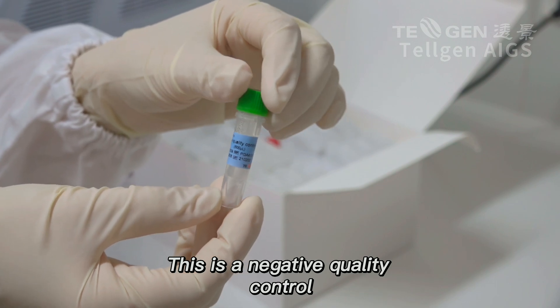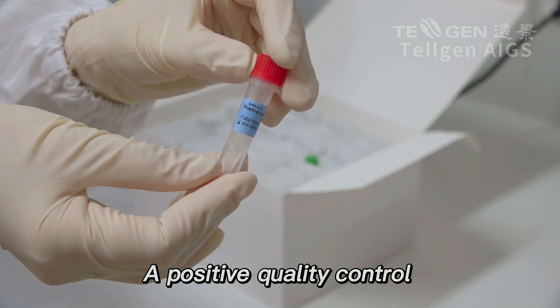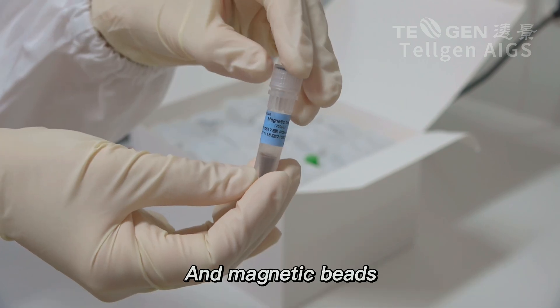This is a negative quality control, a positive quality control, and magnetic beads.